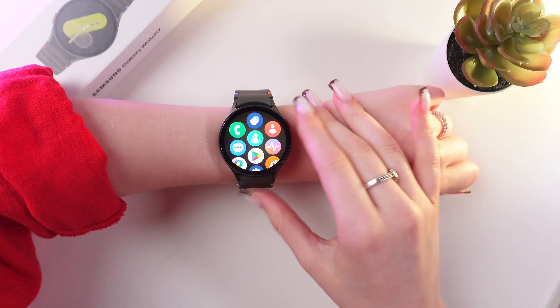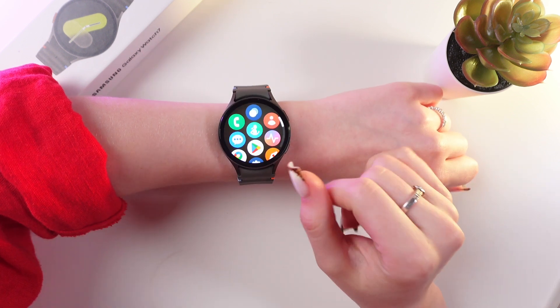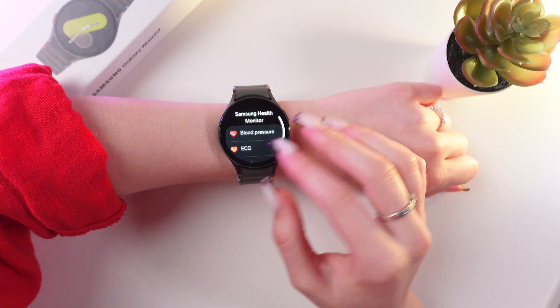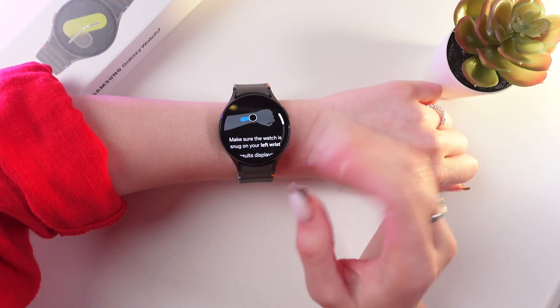Firstly, wear your watch and open the list of applications by swiping up. Here we need to open Samsung Health Monitor, and now we can see the ECG, which is what we needed. Let's tap it.